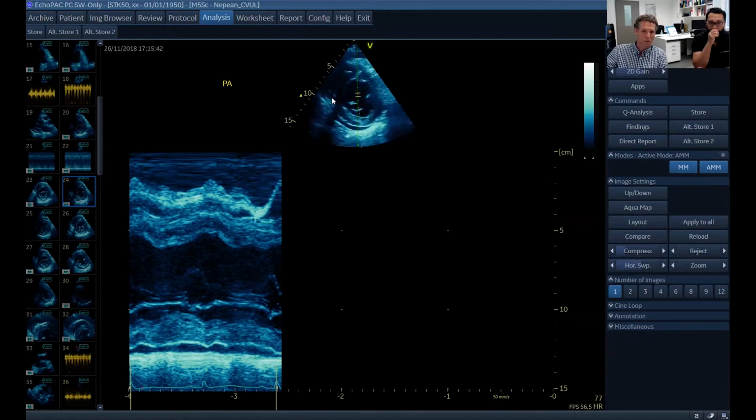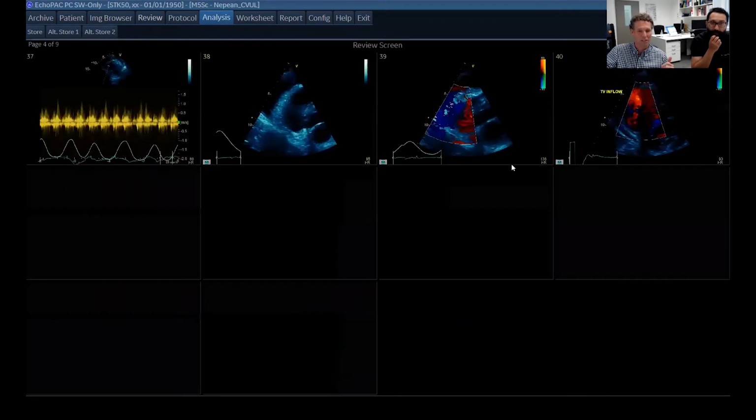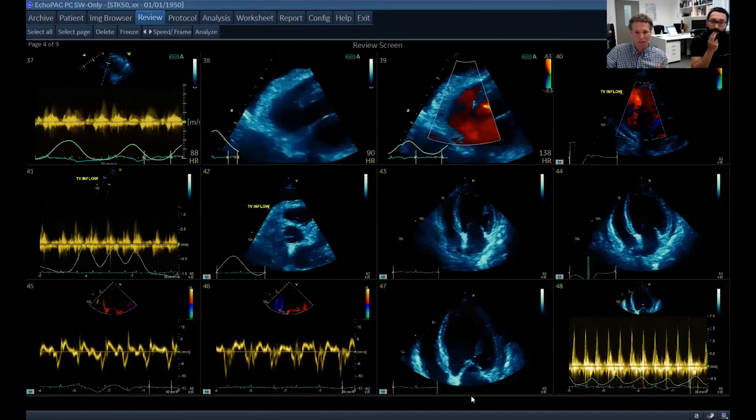Nice. And just quickly to show for everyone here, I've just put an M mode cursor down through this. So I've got the right ventricle free wall at the top of the M mode image here, and we can see it buckling underneath here, as Faraz was saying, during diastole, which is from the end of the T wave to the beginning of the QRS complex approximately. Really nice. So that was the RV. Let's talk about the RA.